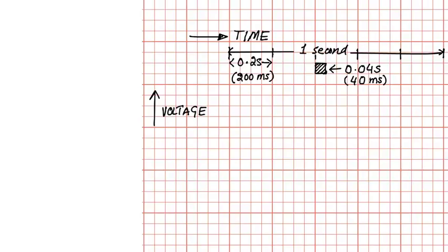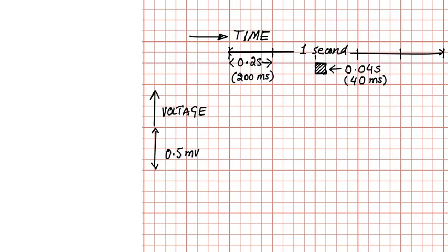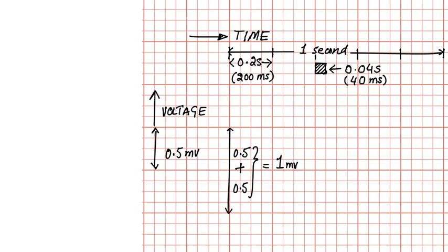The vertical side of the paper measures the amplitude of the EKG. So V for vertical, V for voltage amplitude. One big box vertically is 0.5 millivolts, and of course that means 2 big boxes are 1 millivolt. Why are 2 big boxes interesting? Because most of the time the R wave in the QRS complex is about 2 boxes, a tiny bit above that.